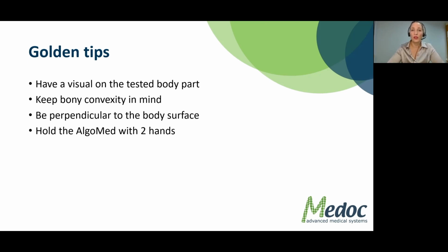If the skin is burned, the skin will also be painful. And then what is it that we're measuring? Okay, because the skin will start hurting as soon as we are applying pressure to it, and maybe we should reschedule this person when we see a situation like this. So these are two reasons why you should always have a visual of the skin and the body part.